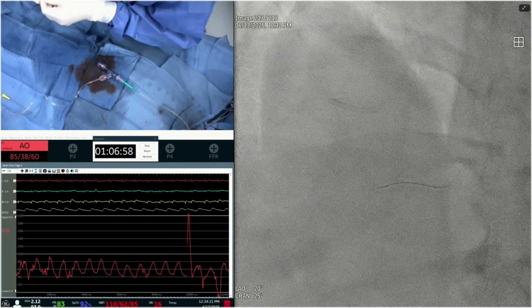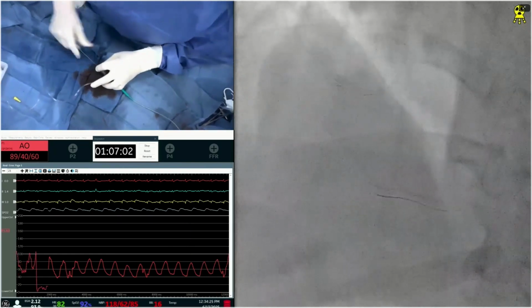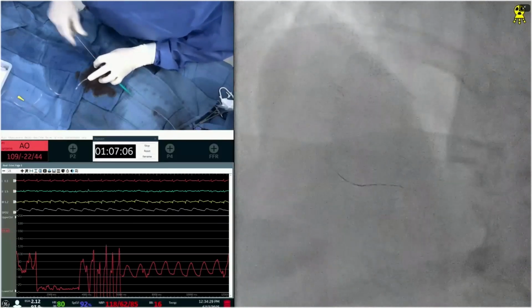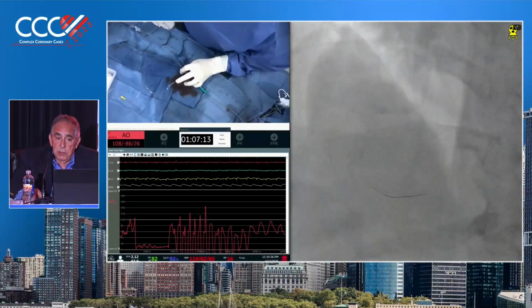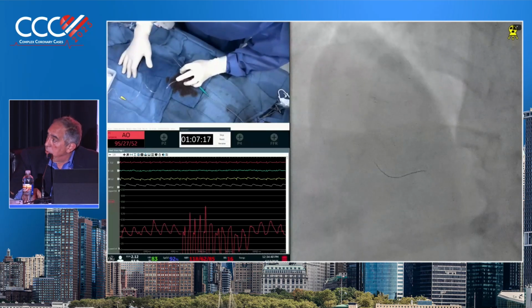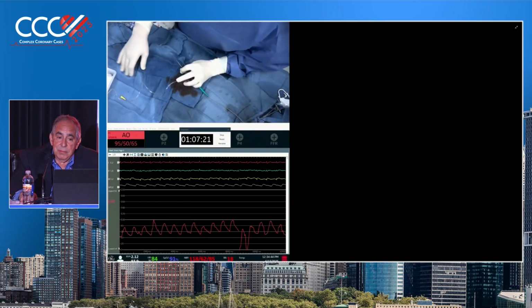And I think that people who are just picking up atherectomy early on actually favor Orbital because it's easier to use. The ViperWire is easy to steer, and it's easy to get it up there and into the lesion. And because of the differences in mechanisms here, you want to take as much advantage of the centrifugal effect and stay on the lesion for a prolonged period of time, unlike Rota, where you're sort of pecking.